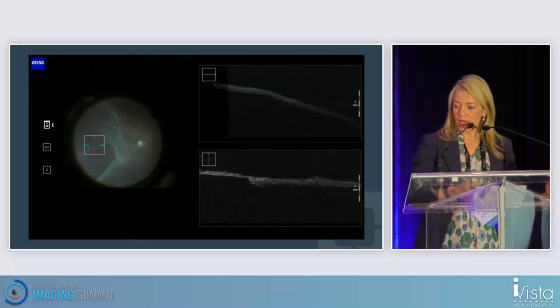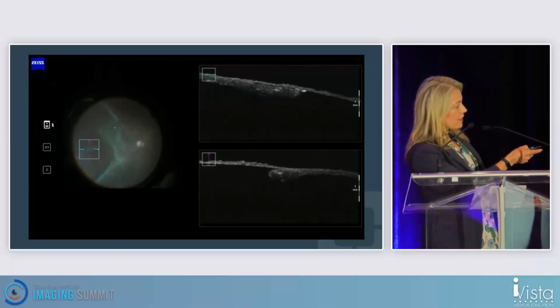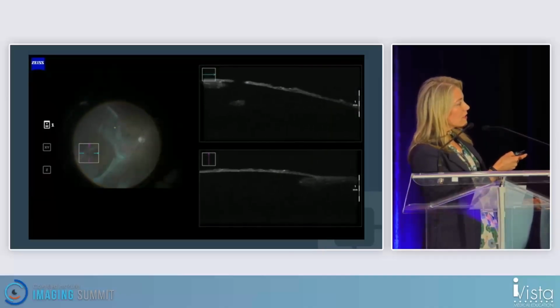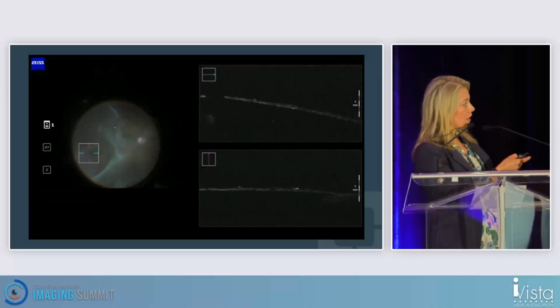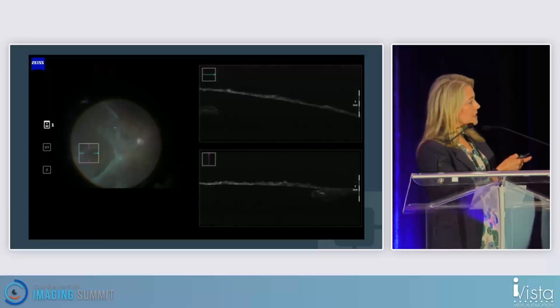And we're doing this intraop OCT, and once again, you see beautiful outer retina, very thin inner retina. And as we keep going, there's this tiny little hole. And a lot of times these patients don't have the classic horseshoe tears. They have very small defects in the inner retina.